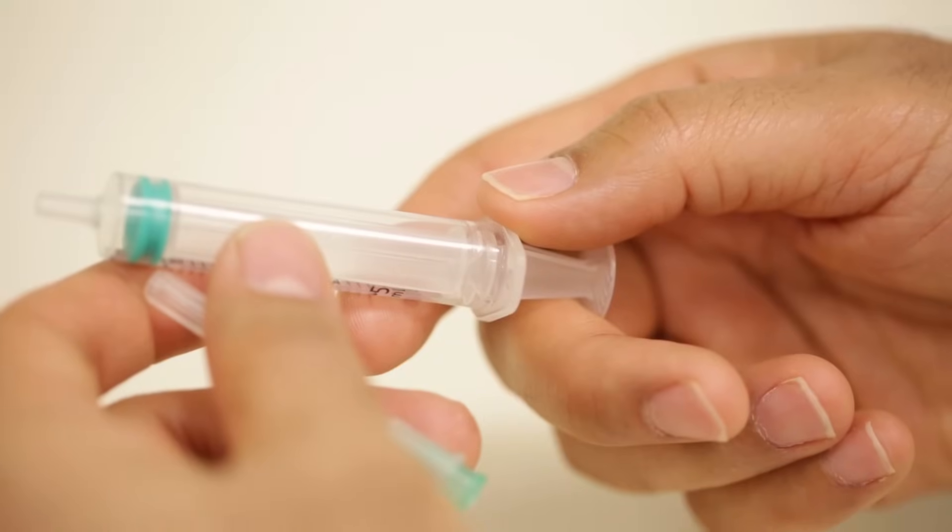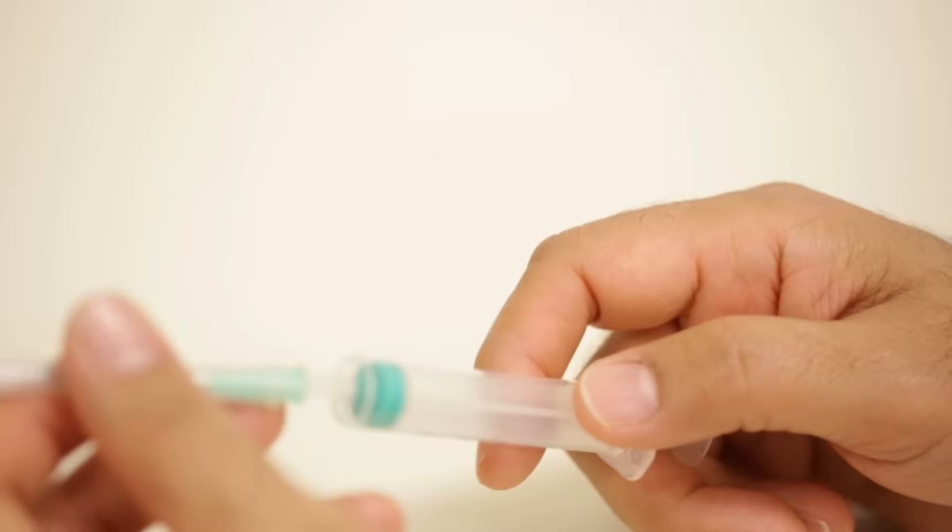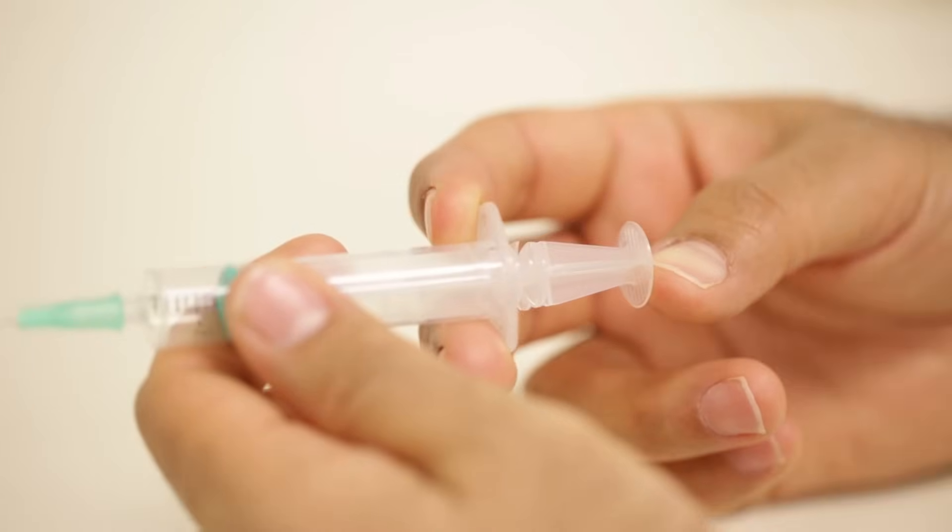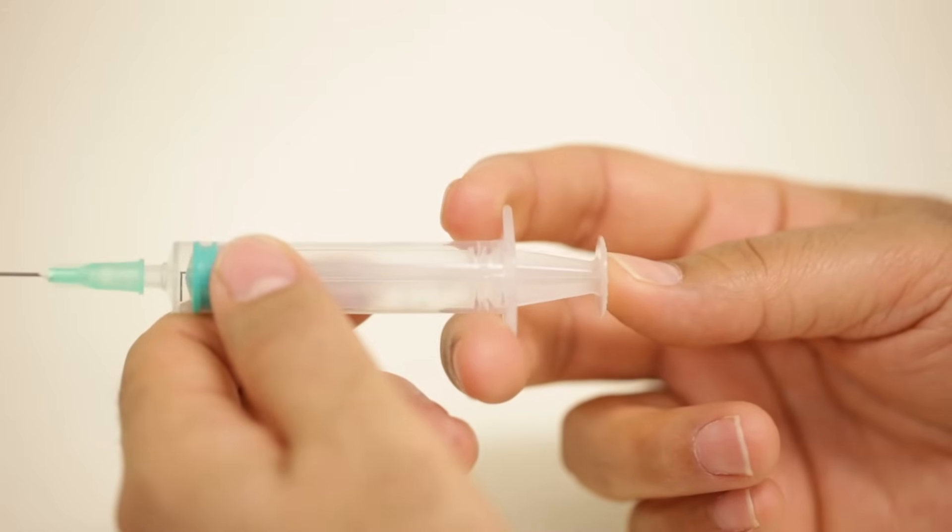This syringe prevents reuse. Put the needle on the syringe. After the injection, continue to push the plunger forward until you hear a click.